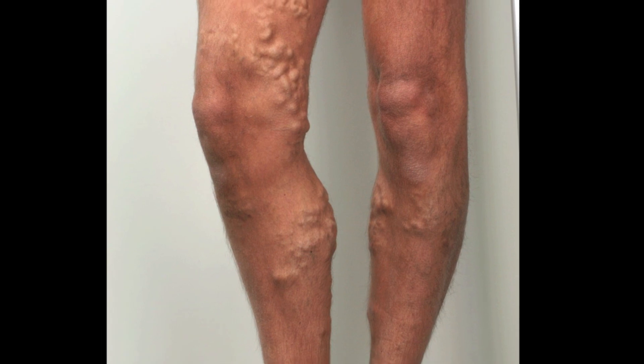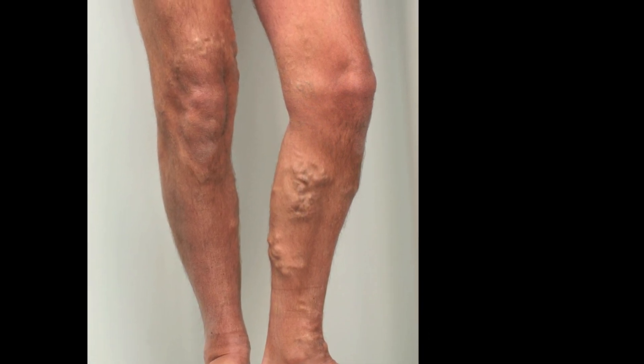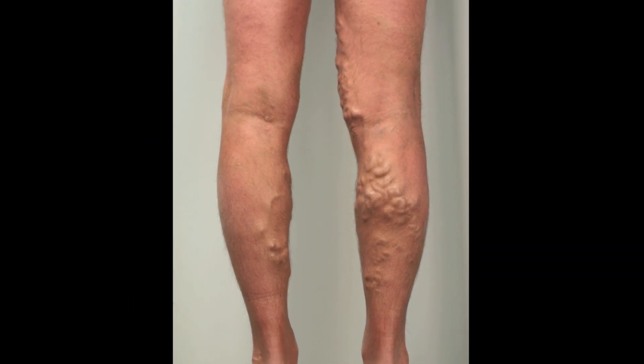Whilst this deals with the superficial vein reflux, and usually the varicose veins under the surface of the skin will decrease in size, getting a really good cosmetic appearance for people with large varicose veins remains a problem. Up until now, the standard technique has been to perform a microphlebectomy using a range of instruments that leave a linear scar — ophthalmic blades, very fine pointed blades, and even needles. Whilst these instruments are good for small to moderate sized varicose veins, the problem still remains how to deal with big varicose veins.